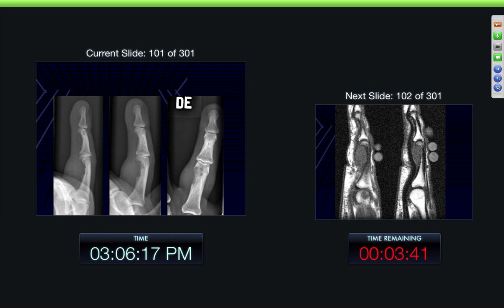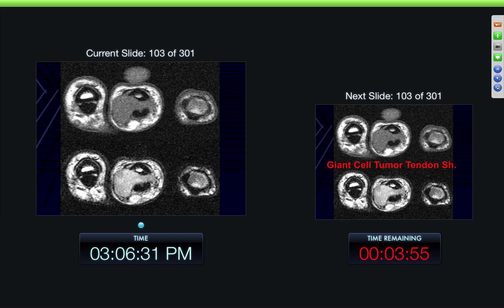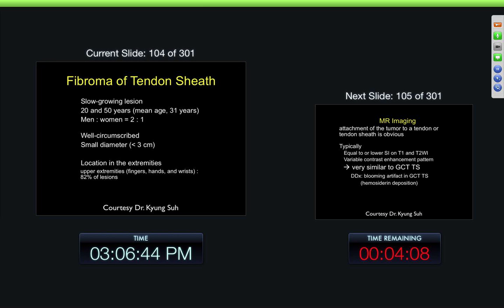Here we can see an extrinsic erosion of the bone in the area where there could be tendons. We can see a soft tissue mass on the plain radiographs and on the MR examination. Again, we can see the low signal intensity mass, low on both the T1 and the T2 with extrinsic erosion to the bone. It's very much associated with the tendon sheath here, and on the PD fat sat we can see some increased signal intensity — that was another giant cell tumor of the tendon sheath.